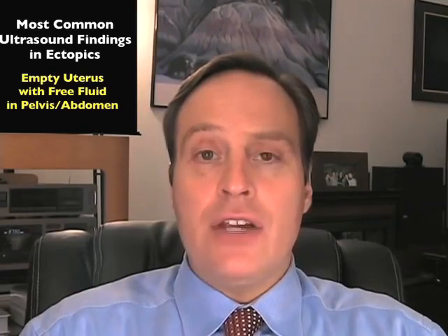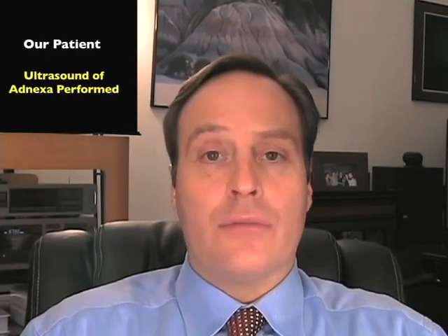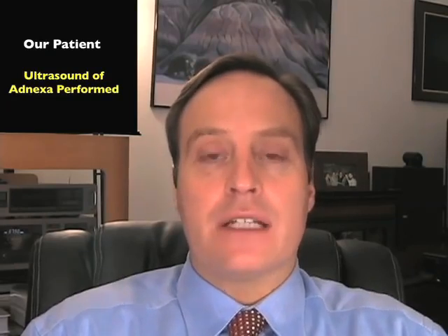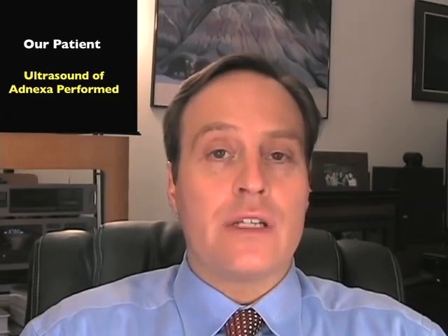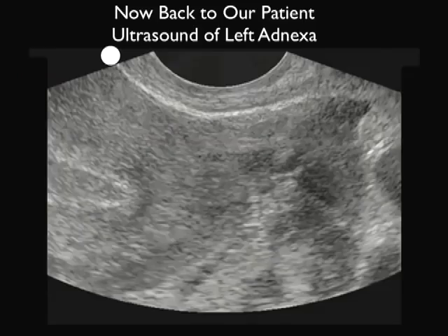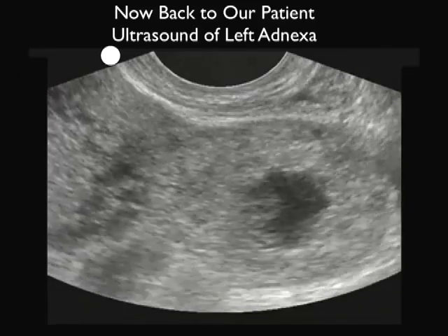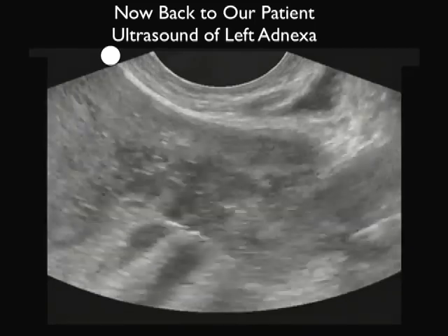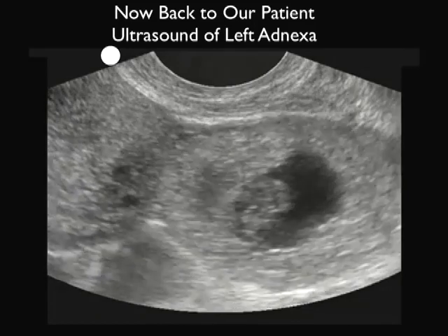So given our patient's very high beta-HCG and the lack of an intrauterine pregnancy, we decided to actually examine her tubes for the presence of ectopic pregnancy. So let's go over the actual transvaginal ultrasound images of the tube that we obtained in this case. So here are the sonographic findings to wrap up the conclusion of the case. Here we're scanning out from the midline uterus, as shown there, out towards the left adnexa. Notice in the left adnexa a positive finding.